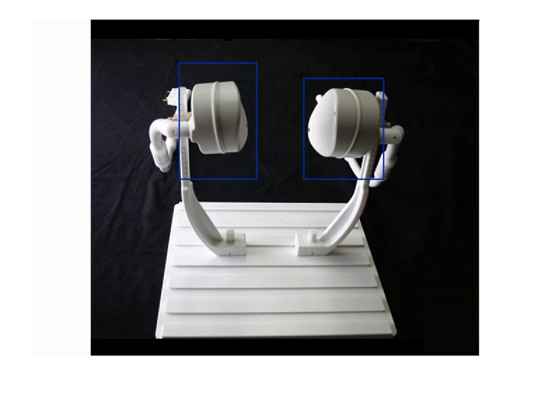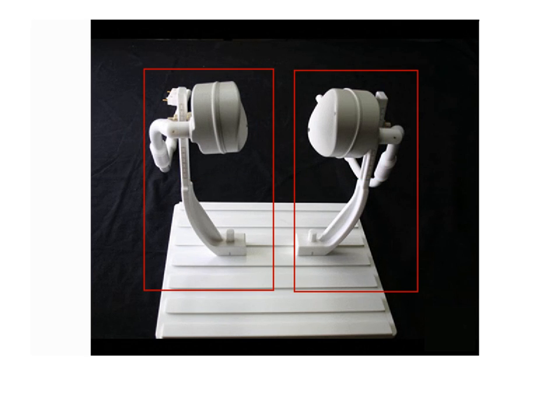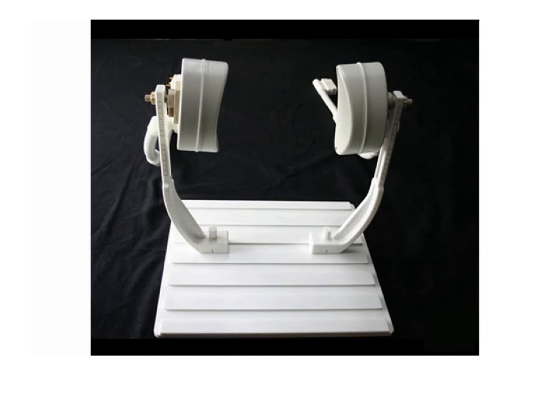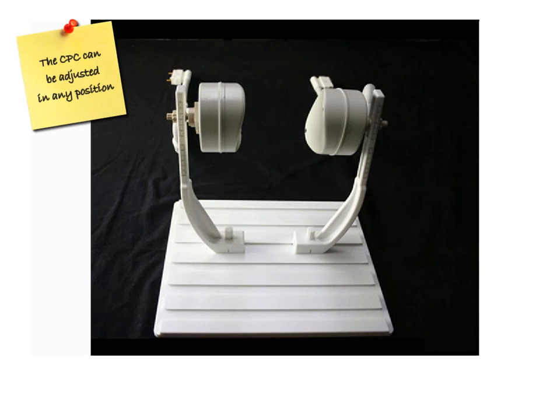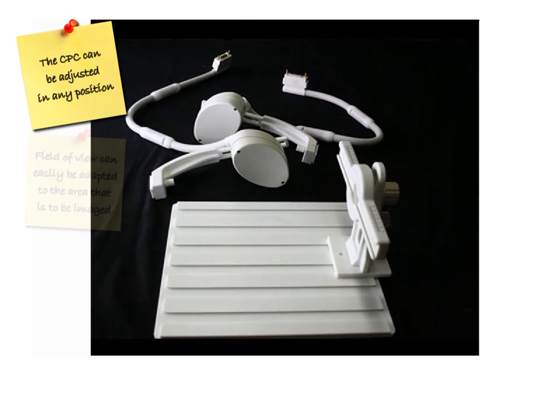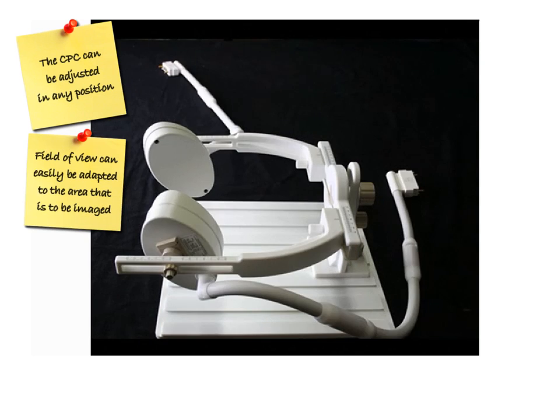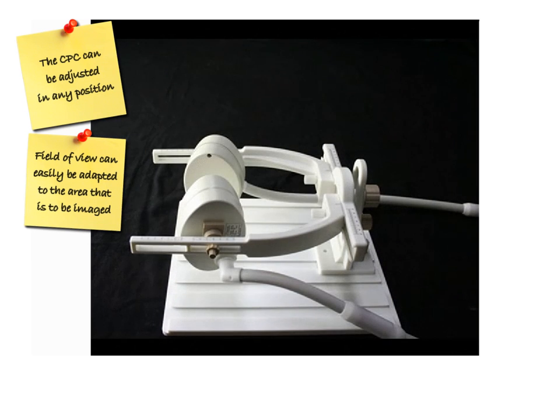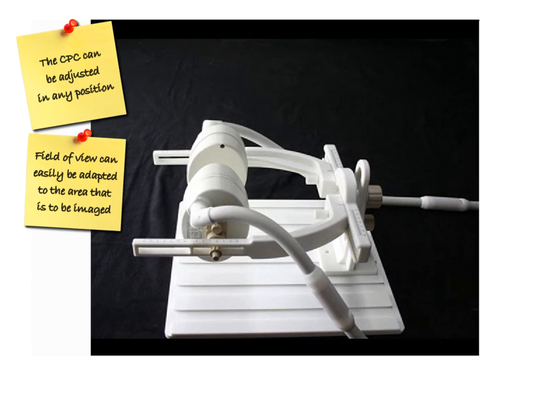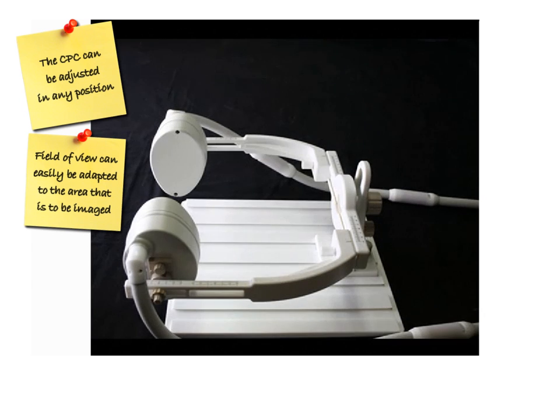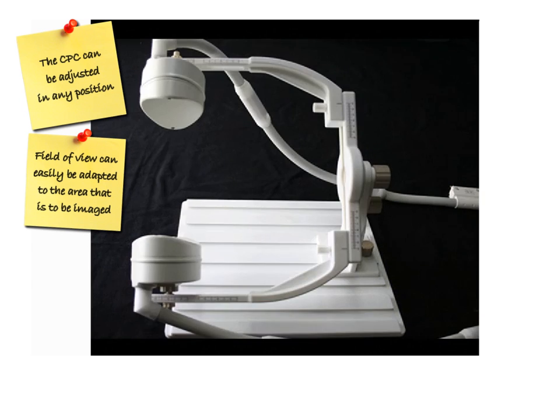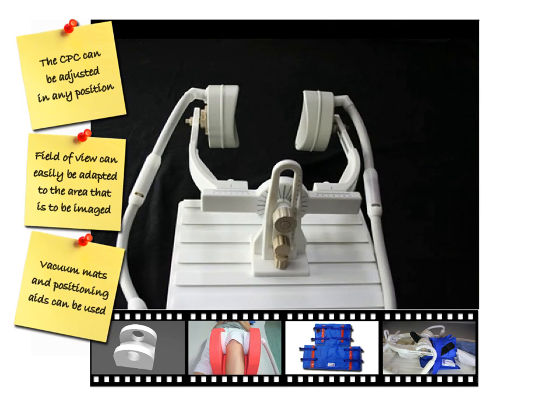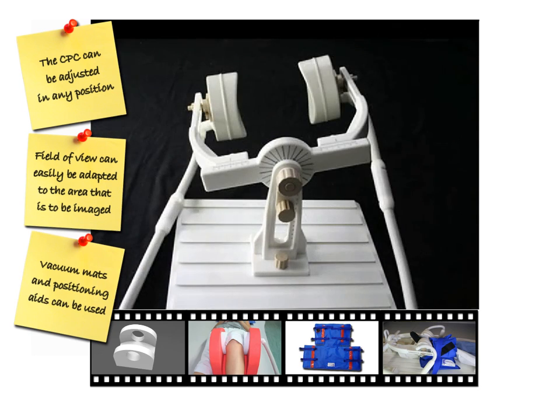The CPC consists of its two shell halves and the base frame. In order to properly image these regions, the very flexible shells and base frame can be easily positioned and aligned in any plane possible. To gain more flexible positioning, a vacuum mattress or dedicated positioning aids can be used.